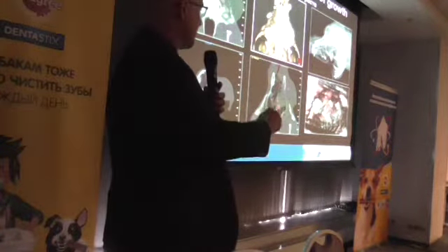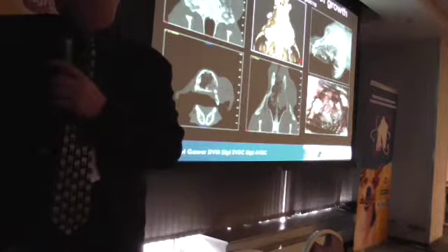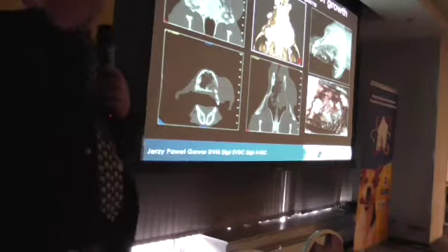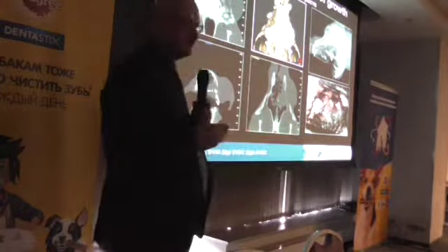Based on the 3-dimensional image, we can estimate, we can see how close to the nasal septum the tumor expands and what would be theoretical section margins.